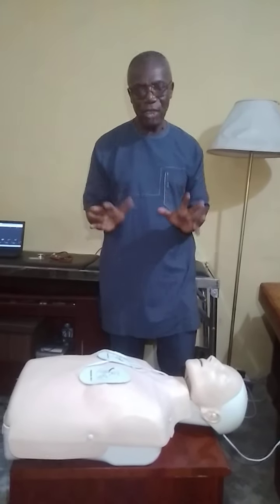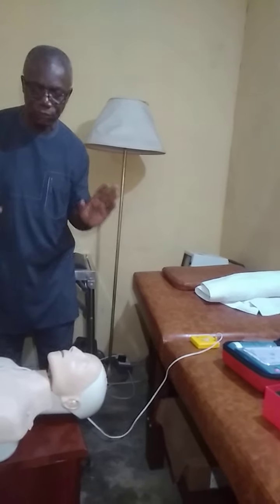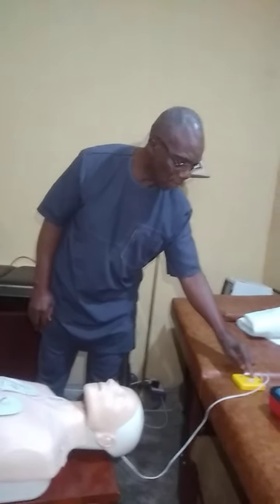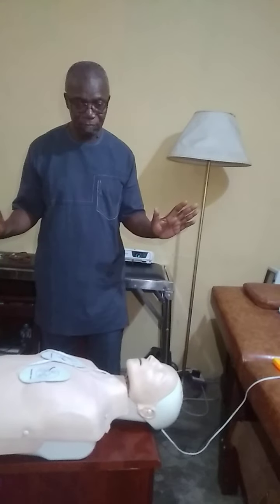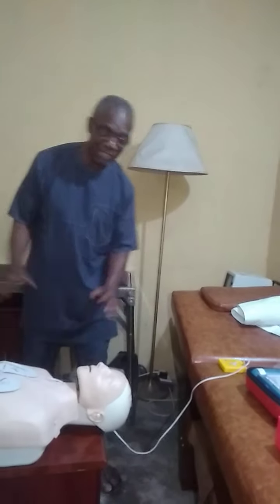Remember also, I mentioned earlier that you don't really have to do anything. Once it's been placed, the machine will do the analysis. So all you need to do is to put it on. But remember also, stay clear. Okay? So I'm putting it on now. I'm pressing the green button. Analyzing. It's analyzing. Do not touch the patient. Now it realizes that shock should be applied. It's charging. Stay clear of the patient.